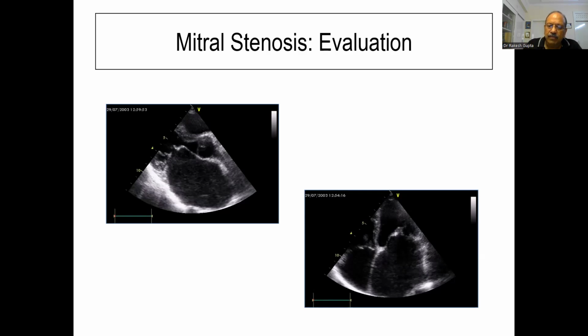Sir, echo contrast fluid is moving. That echo contrast, blood. Who said this word, echo contrast? Arif. Arif, if there would have been a severe MR, this echo contrast would not have been there.